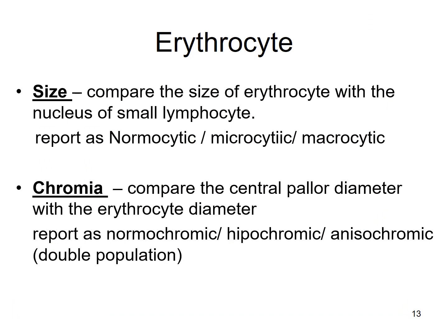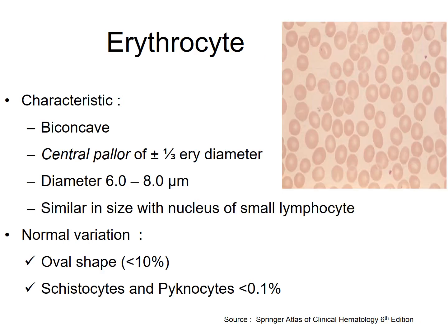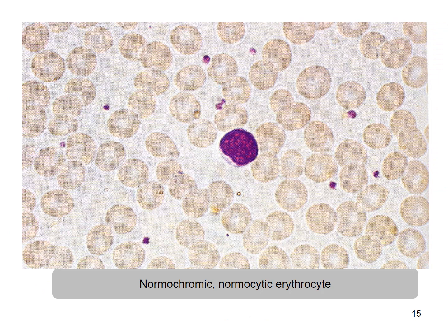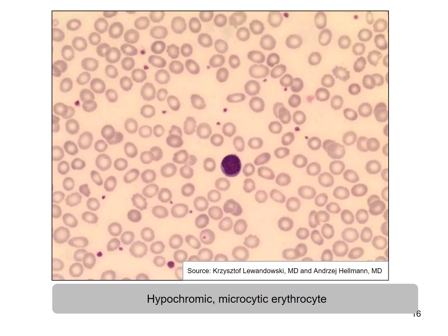The last development stage is the mature erythrocyte. In blood smears, we should examine the size and the chromaticity. Erythrocytes have specific characteristics such as a biconcave shape, a central pallor around one-third of its diameter, and it is about the size of the nucleus of a small lymphocyte. This is an example of a normochromic normocytic erythrocyte — compare its size with the lymphocyte's nucleus. In this picture, we can see a hypochromic microcytic erythrocyte; notice the central pallor is more than half of the erythrocyte's diameter.